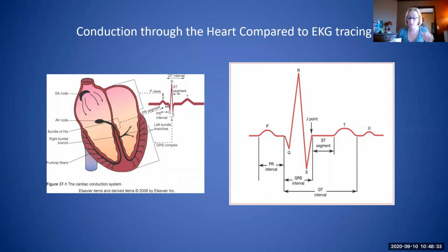And that is the most vulnerable time of the heart. If anything were to happen, like they get shocked or something, and it happens during that period, it can essentially either knock out the rhythm altogether or cause them to go into VTAC. So when we talk in a little bit about cardioversion and defibrillation, it's very important that the patient does not get shocked on the T wave, because that will completely knock out their rhythm or cause a severe dysrhythmia. That's the resting state, and we don't want to disturb it.